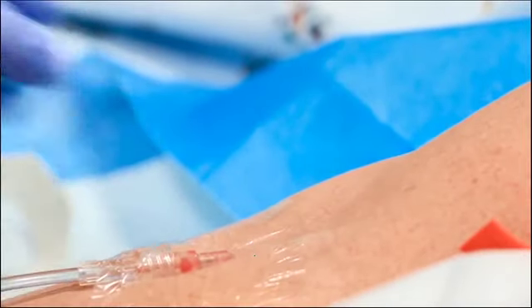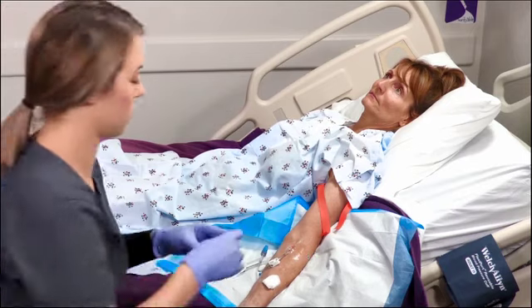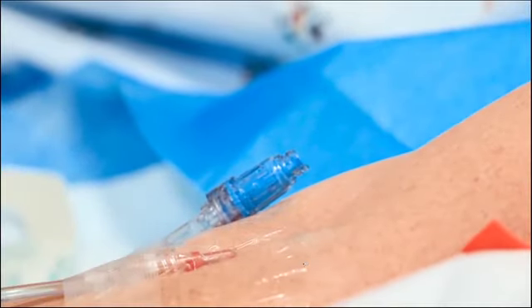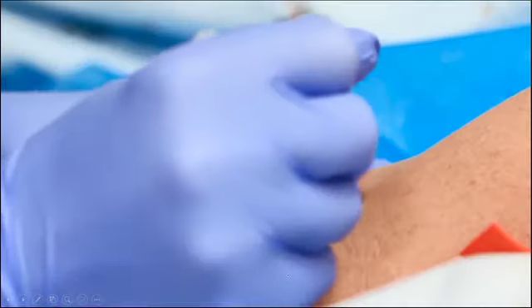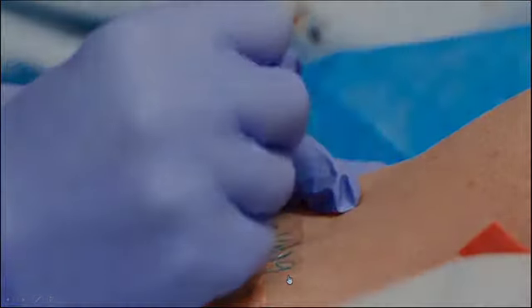Apply your securement device. So in this case, it's a transparent dressing. And then she's going to take another piece of tape and secure the extension set over the patient's arm just to make sure that it's not going to get snagged on anything and pull that IV catheter out. Then finally, like we talked about, time, date, and initials. This is so important for infection control. We want to make sure that we're keeping our patients free from infection.